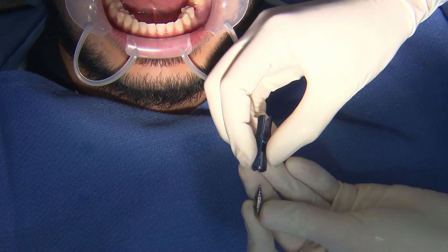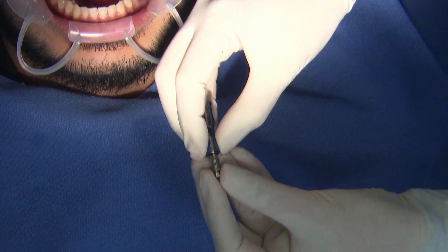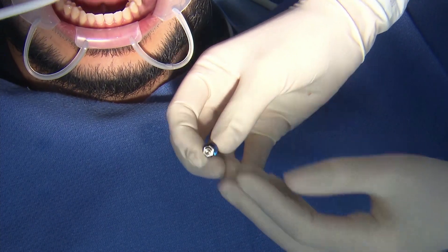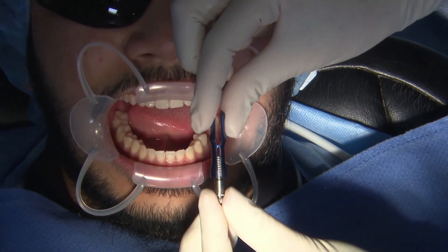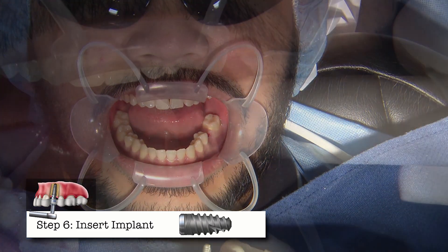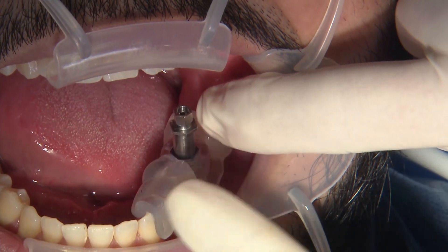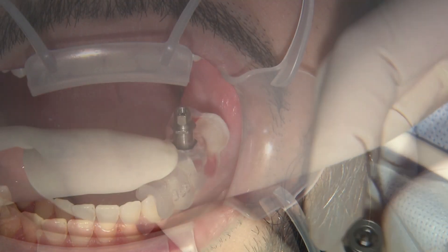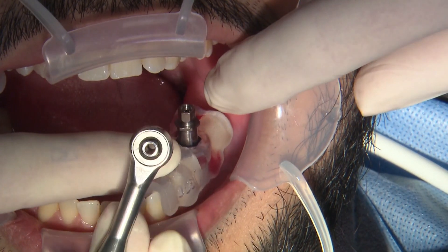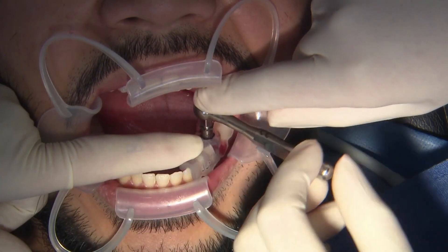It's very important when you attach these together that you squeeze the top portion. You put them together like that and then this gets screwed into place — you can pull it apart by squeezing the bottom. This gets placed right back through just like that and tightened in. You can use your ratchet; you do not need any ratchet with a measured torque on this, as it's going to bottom out with the guide.